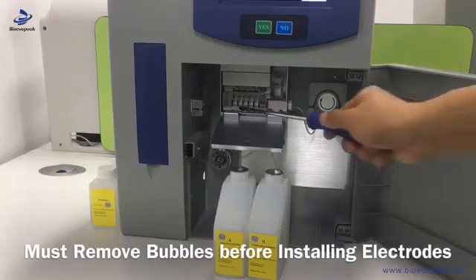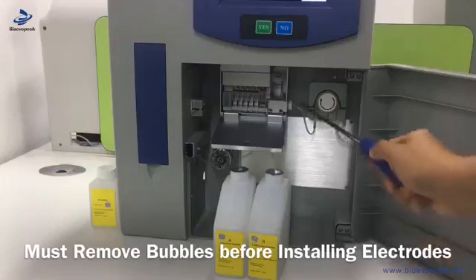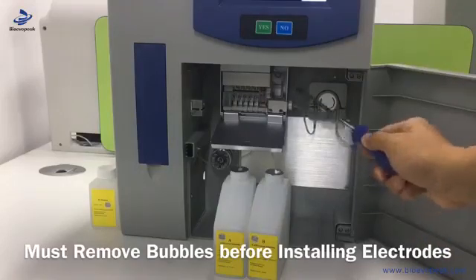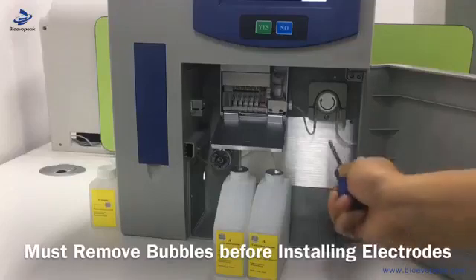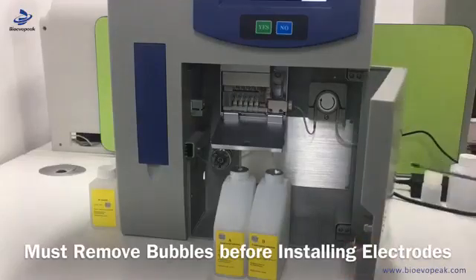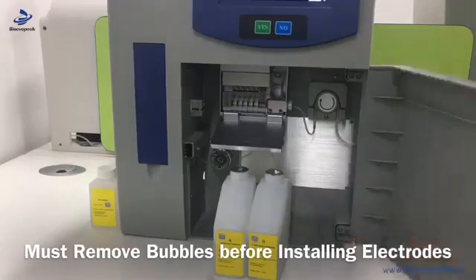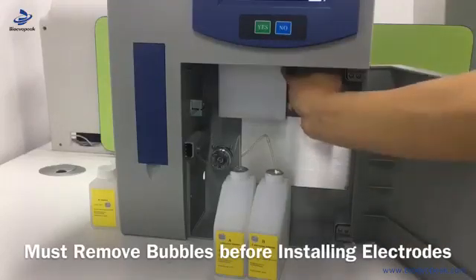First, we need to put the electrodes at the right place and lock the screw well. This is a pump tube and we let the tube go through the hole. Then it can collect the waste. Then we close the electrode box.